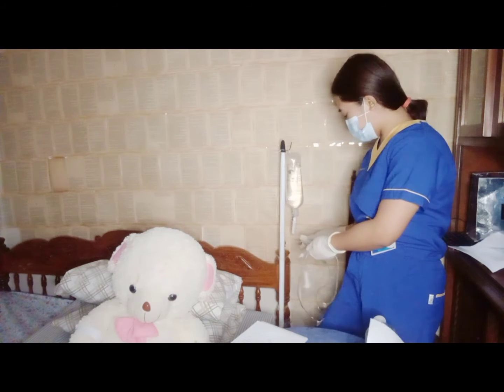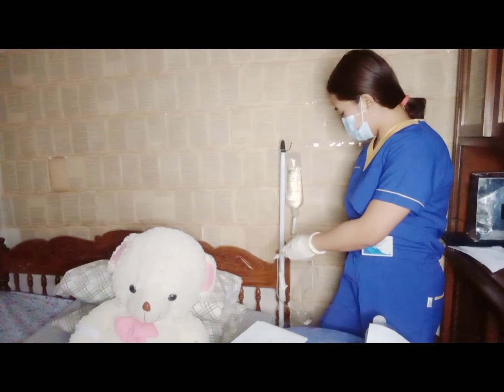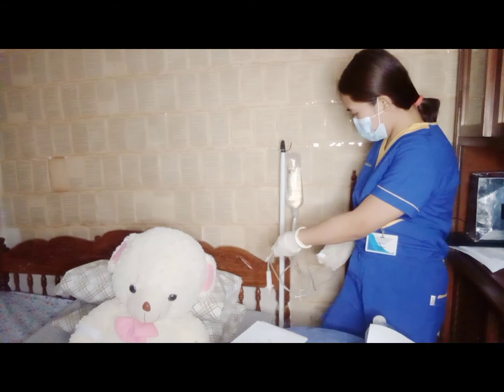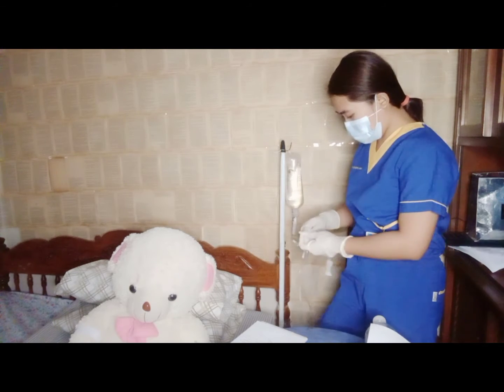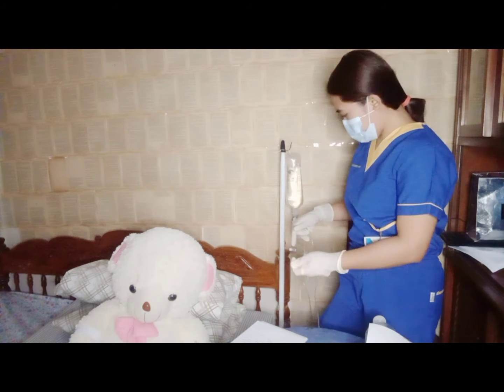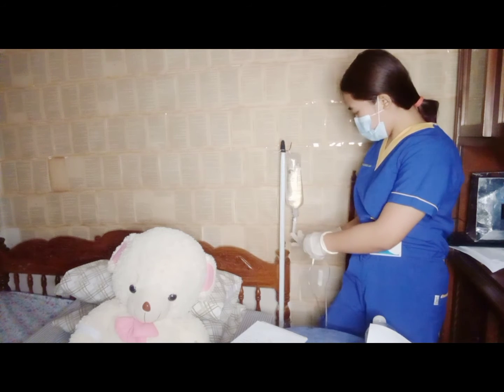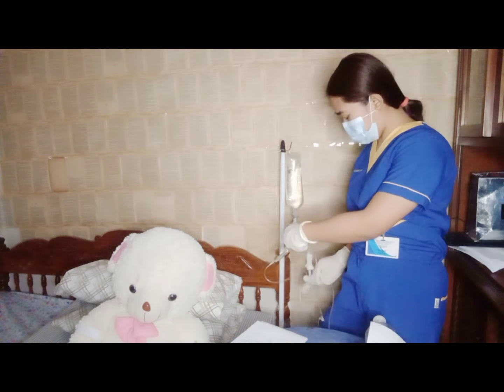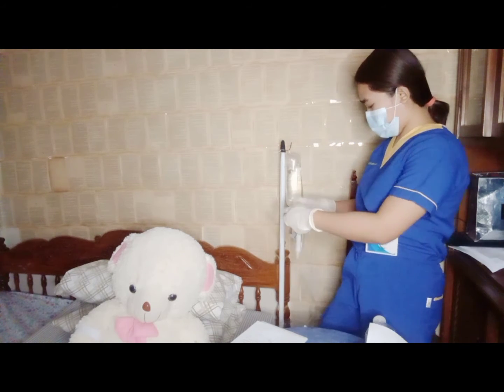Then let's open the clamp. Of course, the other clamp. And then prime the tube. Then after priming, we need to close the clamp sa may saline side, and of course close the clamp of the transfusion side.